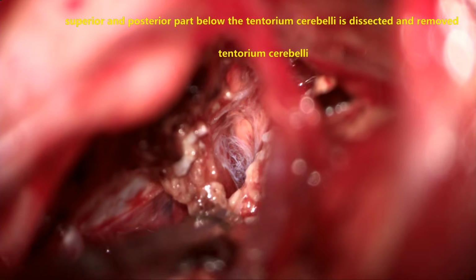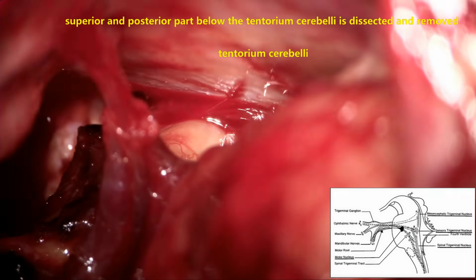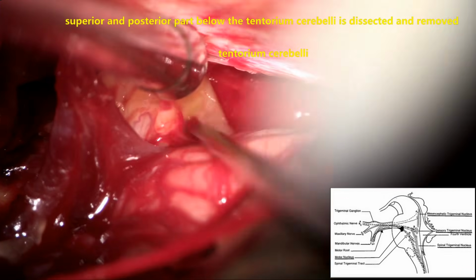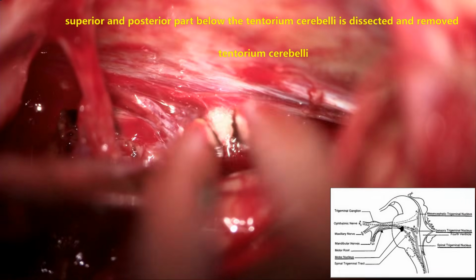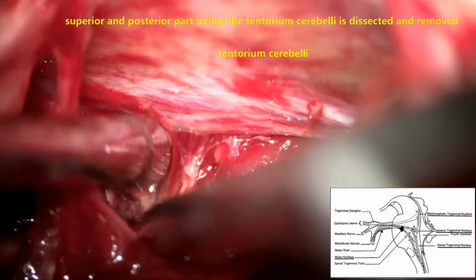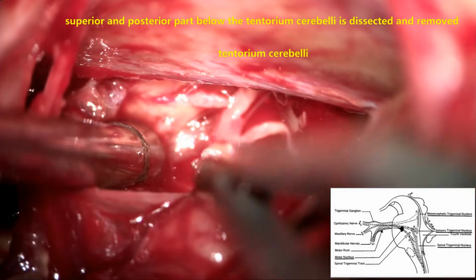Once we do that, now the tumor here is extending below the tentorium cerebelli and the superior part of the cerebellum and the ambient cistern, as it was seen on the MRI. Now you can see the tumor there adherent to the tentorium cerebelli inferiorly. Arachnoid is opened and the tumor is separated.